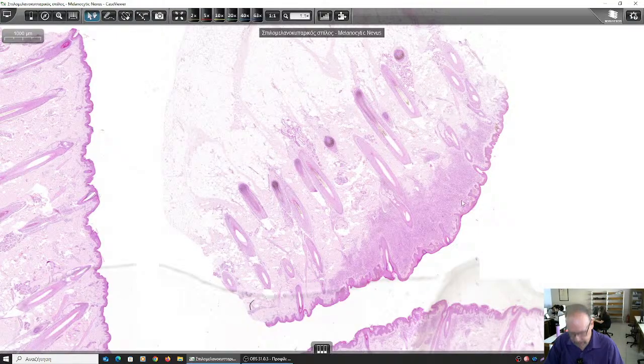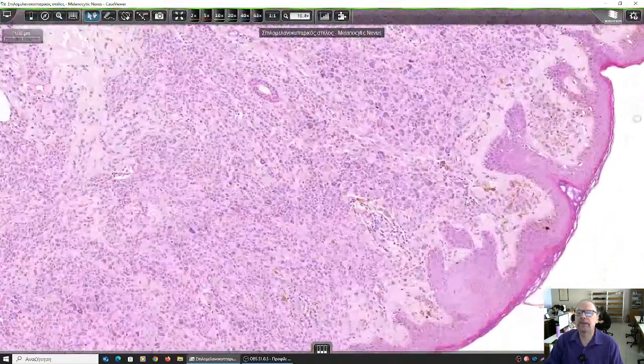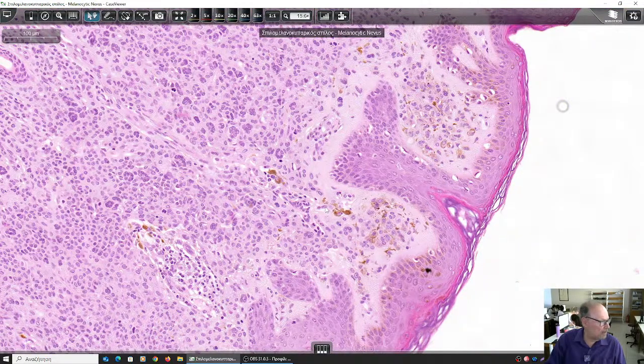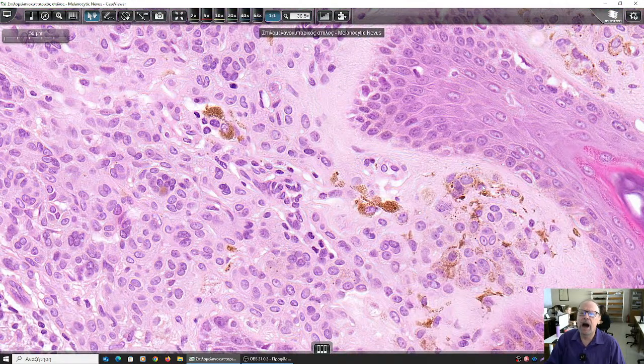Why do I say this? I say this because, can you see signs of differentiation defining the cells making this lesion? It's very easy. What color are the more superficial ones in the microscope? This is a sign of differentiation. What color are they? They are brown. Which is the brown pigment of the skin? Which one is it?